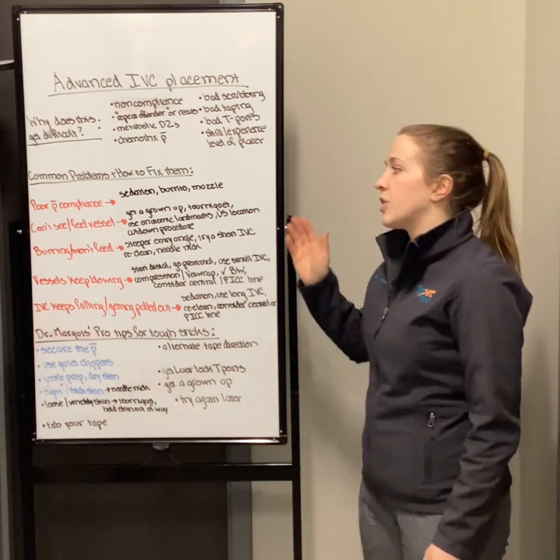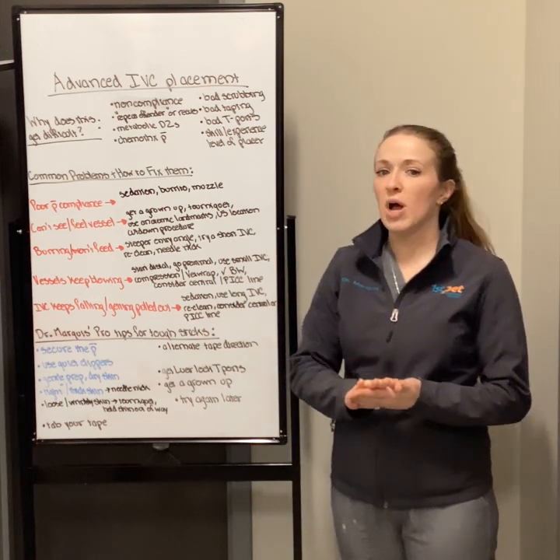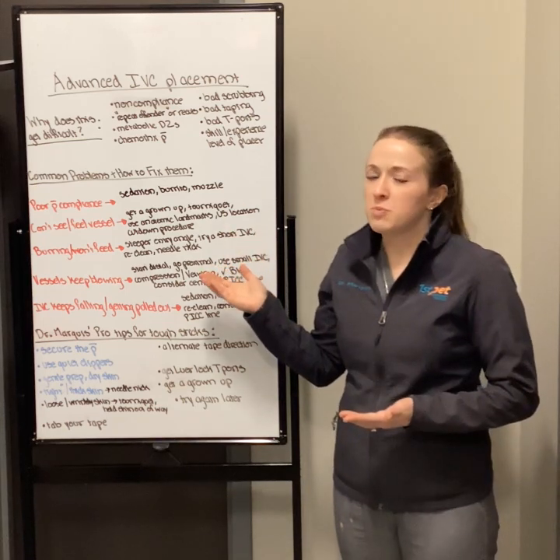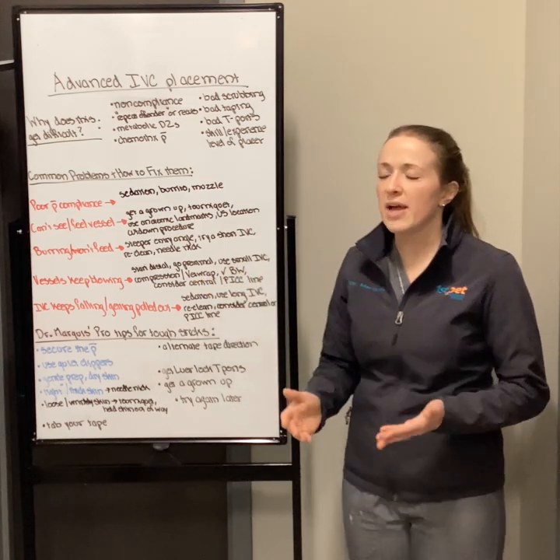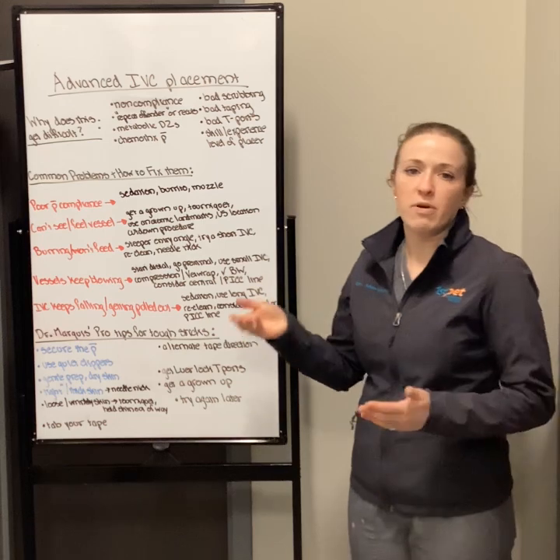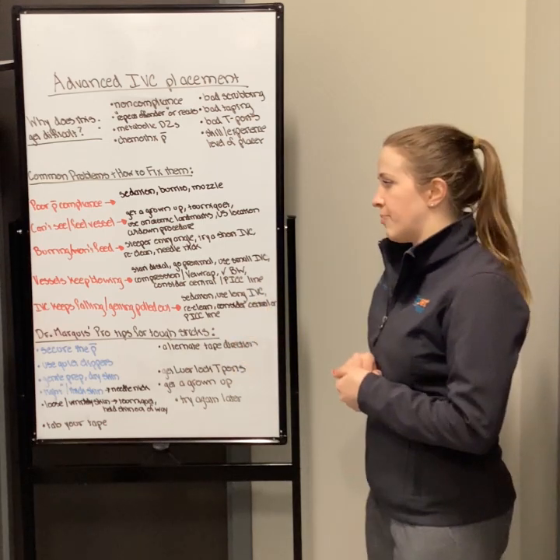If you have an animal that doesn't want to cooperate and you need a catheter for fluids, drugs, life-saving medications, it would just be much better to sedate them and get on your way. Because if the animal is relaxed, it will tolerate you doing all of those things. So for patient noncompliance, we have two big ways we can go: physical restraint and chemical restraint.